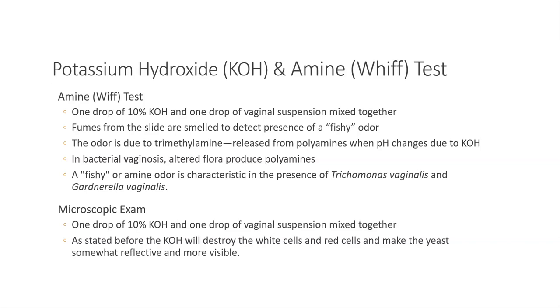For the microscopic exam, 1 drop of 10% potassium hydroxide is added to 1 drop of the vaginal suspension and mixed together. As stated before in this presentation, the KOH will destroy any white cells and red cells, and that will make the yeast more reflective and more visible.